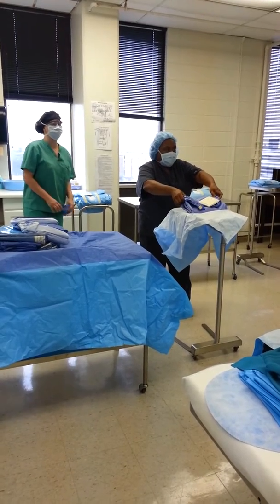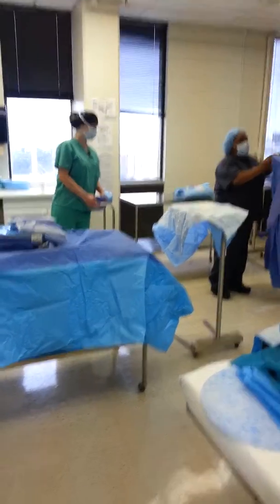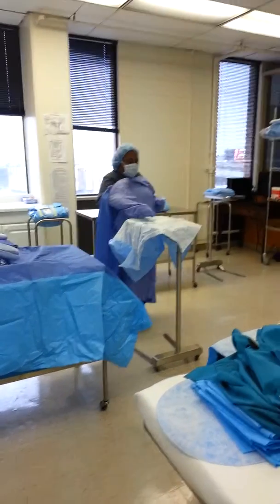Okay, if your circulator's not there, I would drop it somewhere. Whether it's in the trash can, or on the OR bed, because remember, my patient is not in the room. So I can drop it on the OR bed until the circulator comes to get it? Yes, okay.